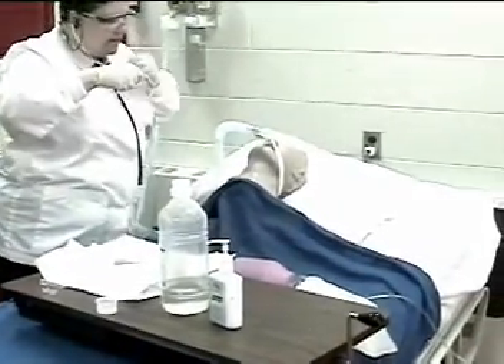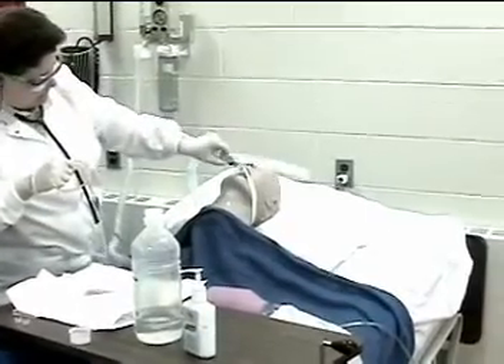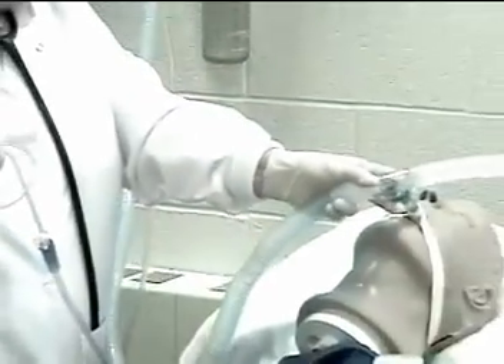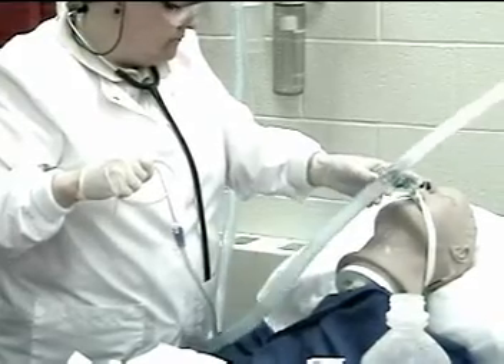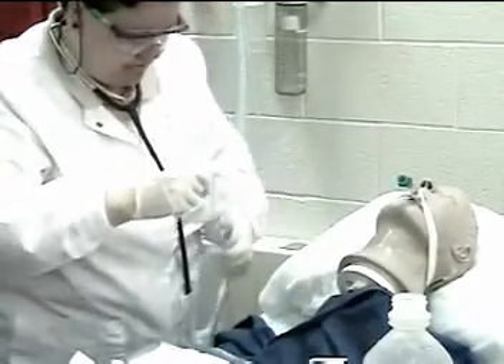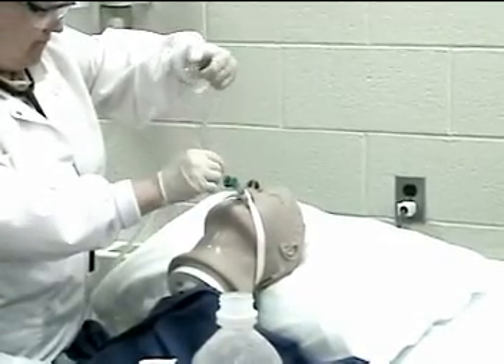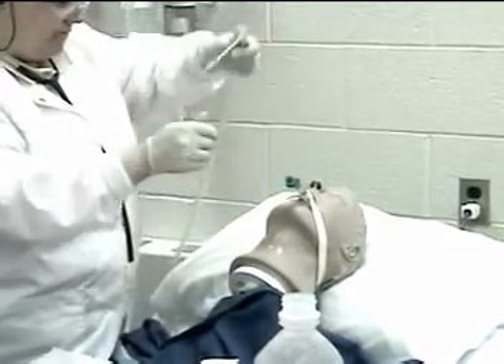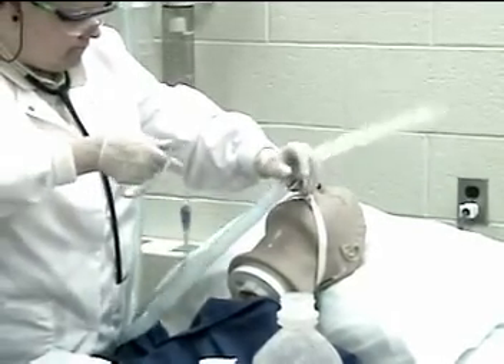Still sounds a little bit gurgly in there. At this point, injection of a sterile saline down the endotracheal tube may be beneficial. I'm just going to put a little bit of saline down in your endotracheal tube — just a little bit of fluid to help loosen up some of that mucus. I'll give you a couple more good breaths of oxygen. I know that often makes people cough. Then suctions the patient maintaining sterile technique, ensuring the catheter is not contaminated at any point other than with internal portions of the endotracheal tube. Repeating suction for no greater than 15 seconds. Hyper-oxygenates and if necessary uses a manual resuscitation bag.